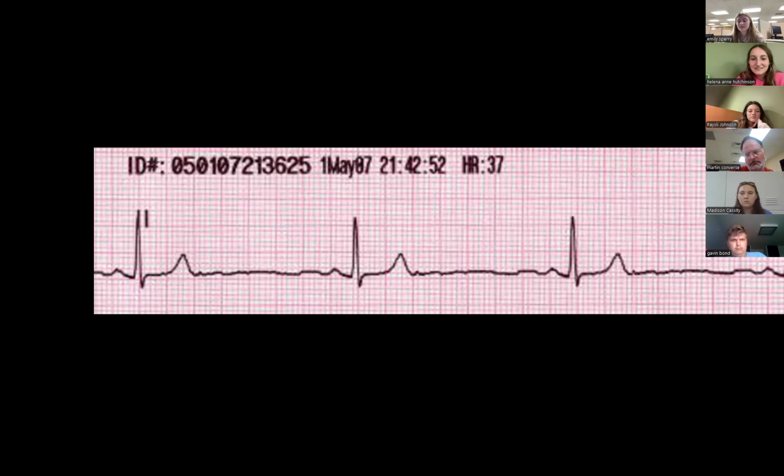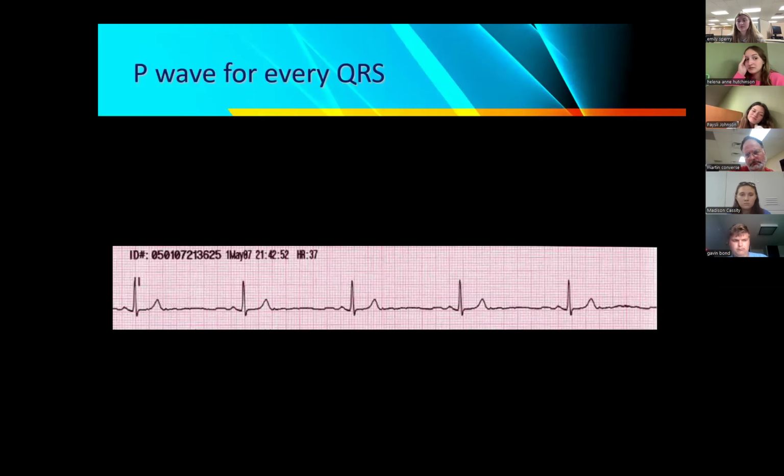Take one last look at the QRS. Tell me, is that normal or abnormal? Normal. Excellent. Okay. So, Paisley, what's this rhythm? Sinus bradycardia. Named it. Good. All right. Sinus bradycardia. Now, let me ask you guys, and I'll throw this out to everybody. Let me magnify it just a little bit of a review.